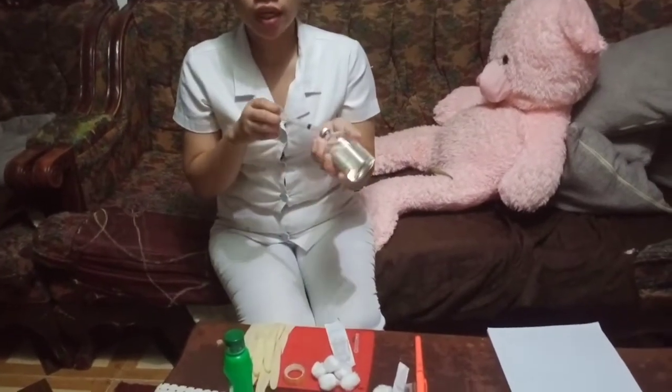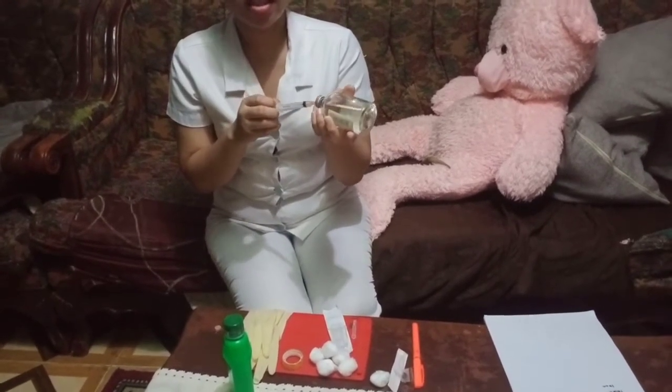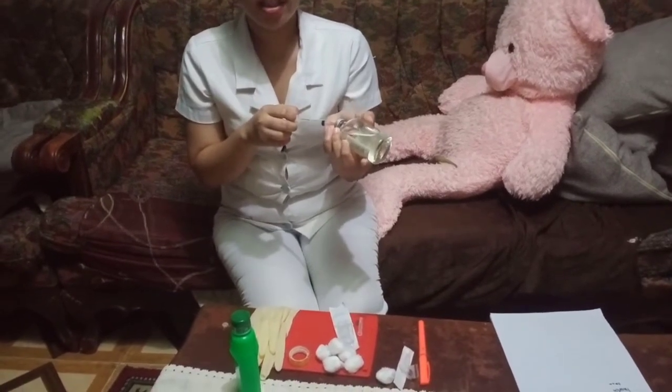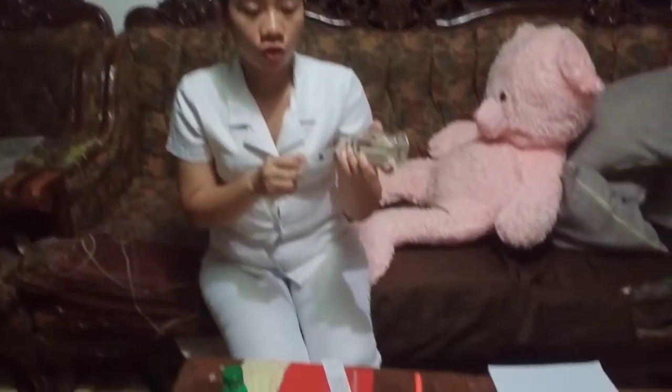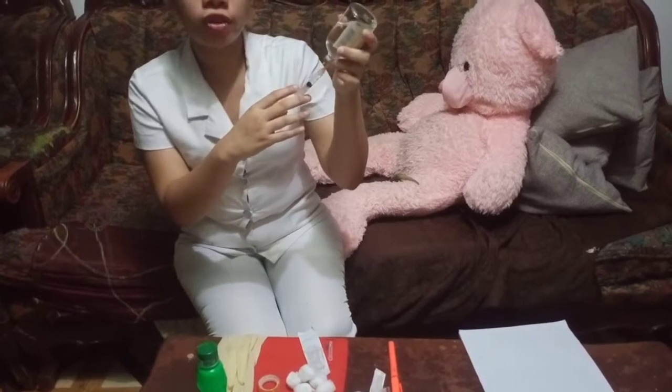At eye level, inject the air into the vial, keeping the needle above the surface of the medication. Now withdraw the prescribed amount of medication using either of the following methods.